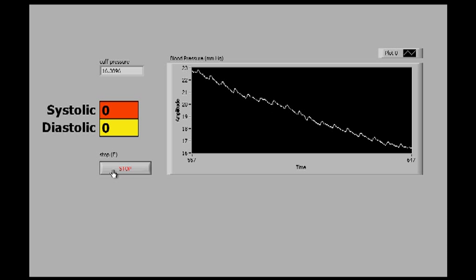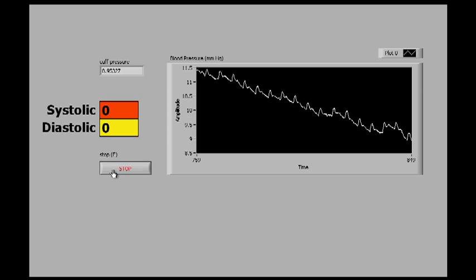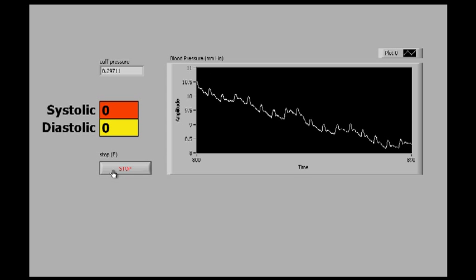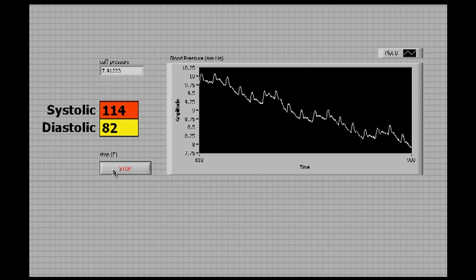Just above ambient pressure, at 8 millimeters of mercury, the solenoid valve opens to release the remaining air in the cuff. The entire run of collected data is then passed to the blood pressure sub-VI, which computes the systolic and diastolic pressure readings.